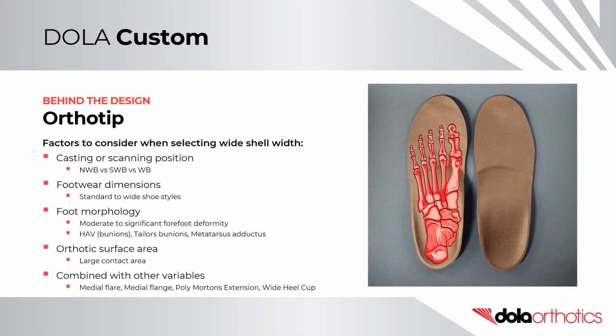Orthotip. Factors to consider when selecting a wide orthotic shell width include the casting or scanning position. What foot morphology has your cast or scan captured? Footwear dimensions. This choice can be suitable for standard to wide shoe styles.